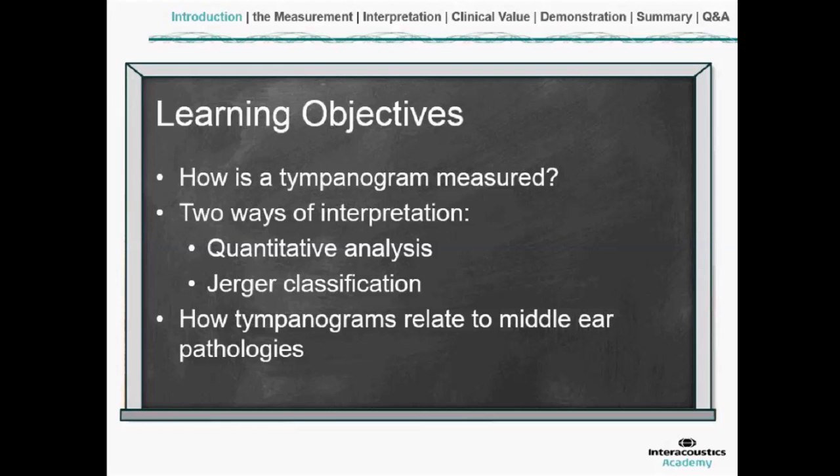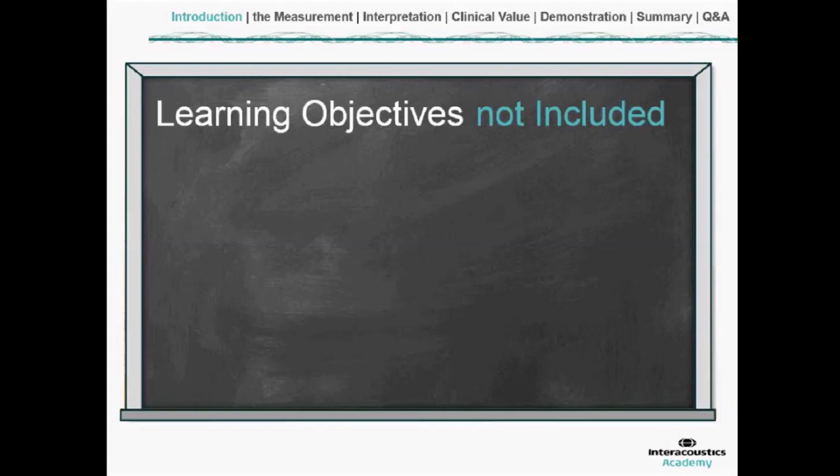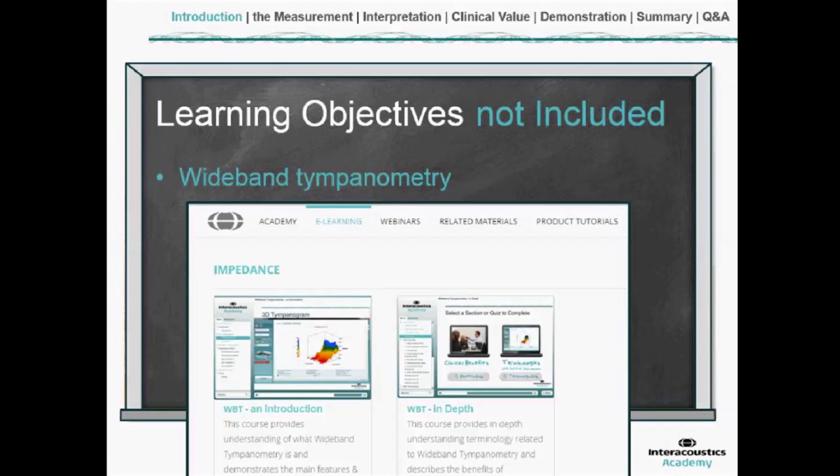Then I will tell you what the meaning is clinically of different shapes of tympanograms, and we'll have a short discussion about how valuable it is to do tympanometry. There are also a few things that I do not include in this webinar, and I'll better bring it up front. I won't be talking about wideband tympanometry, however, that is very interesting. If you would like to learn more about wideband tympanometry, then after this introduction, I think it would be very useful to go to our internet webpage.